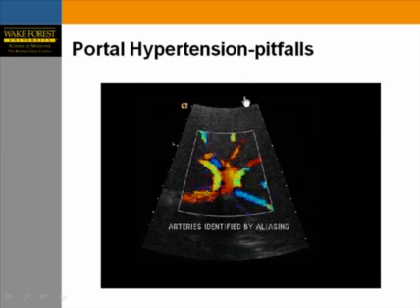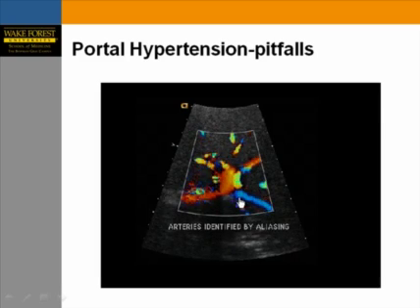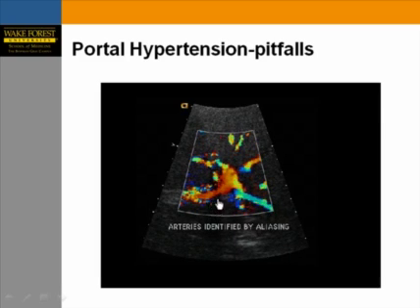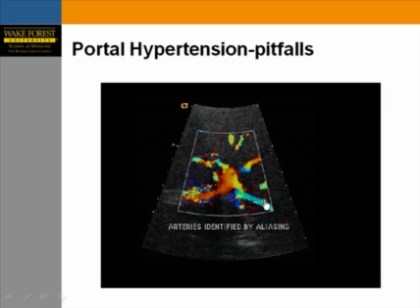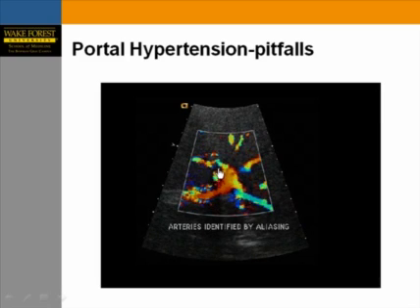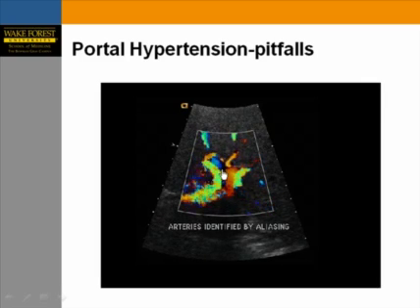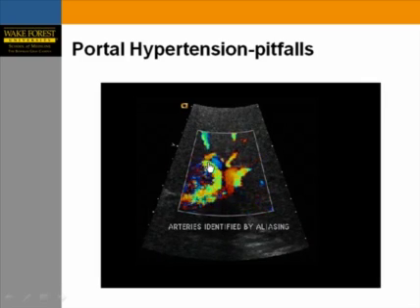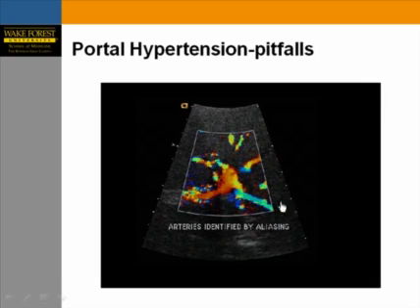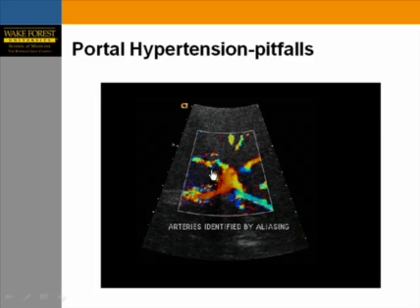Another example of portal hypertension: the main left portal vein appears fully hepatopetal, but careful inspection reveals an enlarged hepatic artery indicating decreased portal venous flow, and a tiny anterior branch of the portal vein shows reversal. This tiny reversal indicates an element of portal hypertension. The combined color picture of the main vein, arteries, and all branches helps establish the right diagnosis.